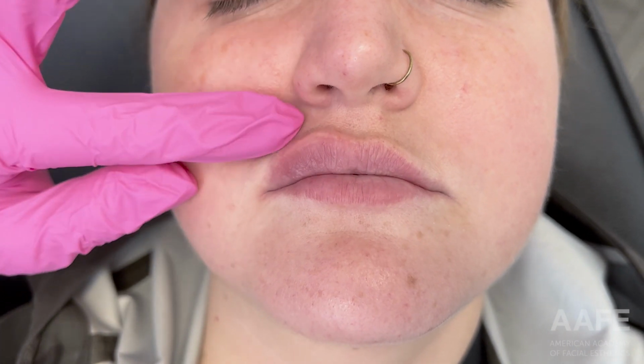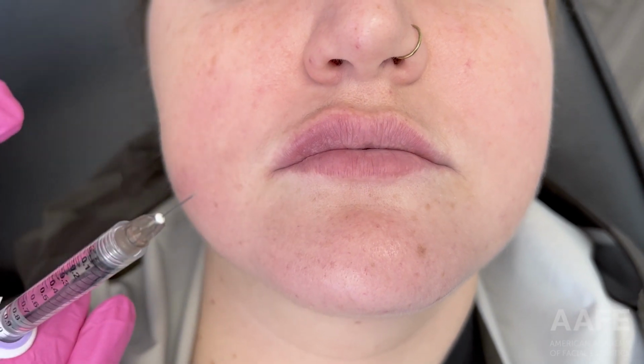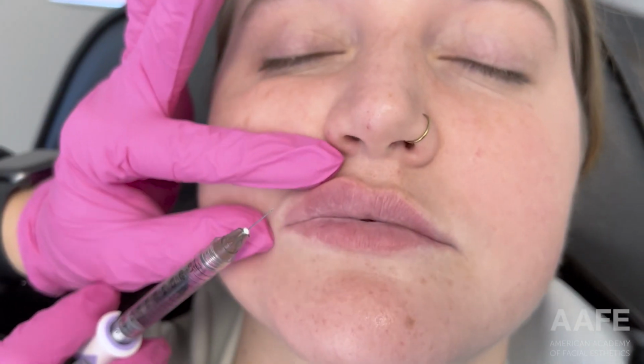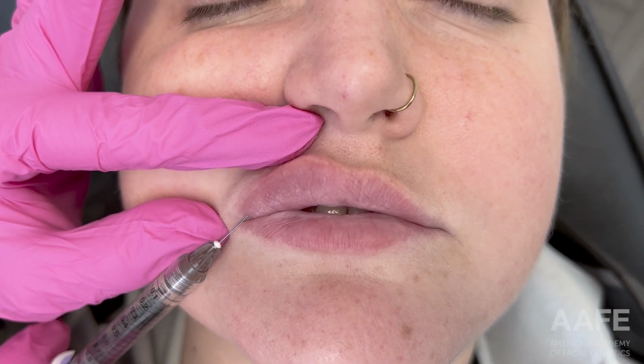Now you can see that this looks a little firm there, a little dimpled, if you will. No big deal. We are going to smooth that out. I do not like to smooth while I'm filling. I like to wait until the end because the patient will swell and then we won't be able to tell what's what. Another thing, you might have just noticed that there was a little bleb of product at the tip of my needle. I see so often injectors wipe with their glove. We don't want to do that. We want to stay sterile. So I just gave it a flick. Or you just go ahead and continue injecting. The filler's going into the body of the lip anyway, so it's no big deal if it's there.